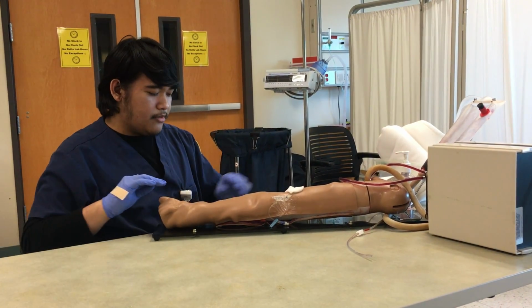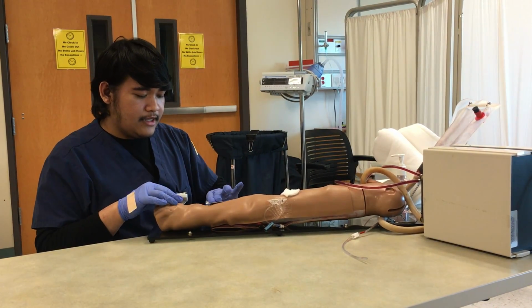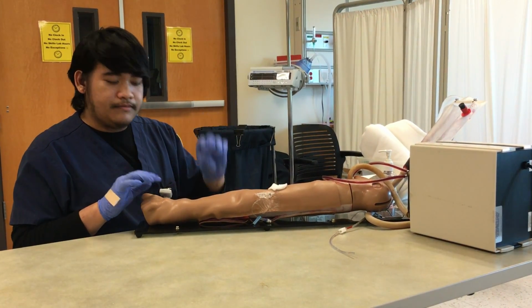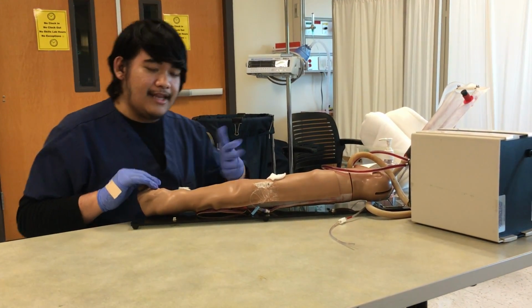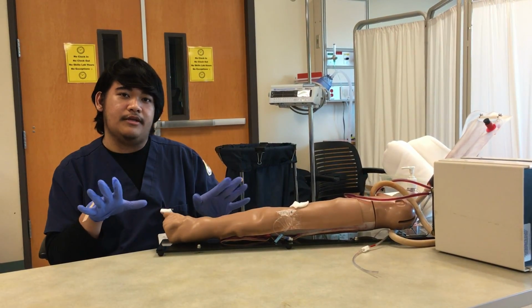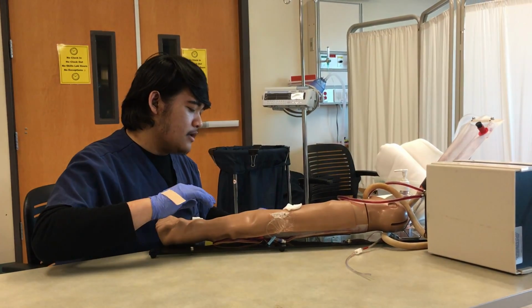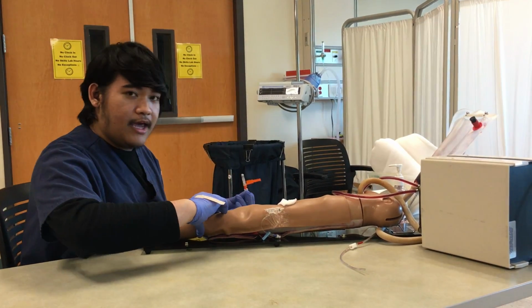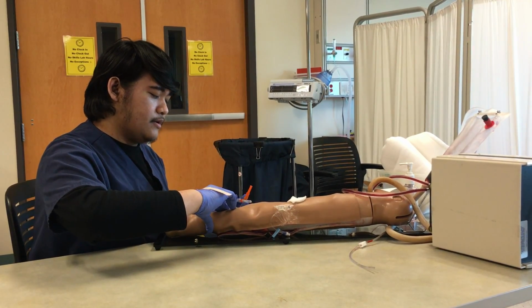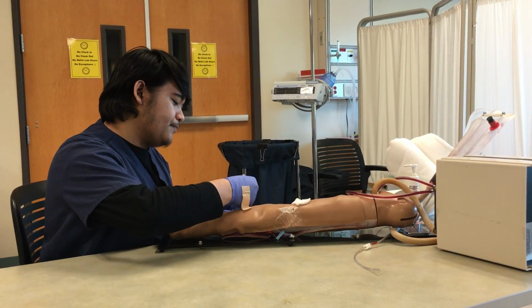So once I feel it, I'm going to clean it with an iodine. Clean the site, circular motion, alcohol, circular motion, and let it dry. Make sure that the alcohol is completely dry because it could be more painful for the patient when you puncture them. So once it's all dry, I'm going to feel again where I'm going to poke the patient. So I'm going to feel for the strongest pulse.